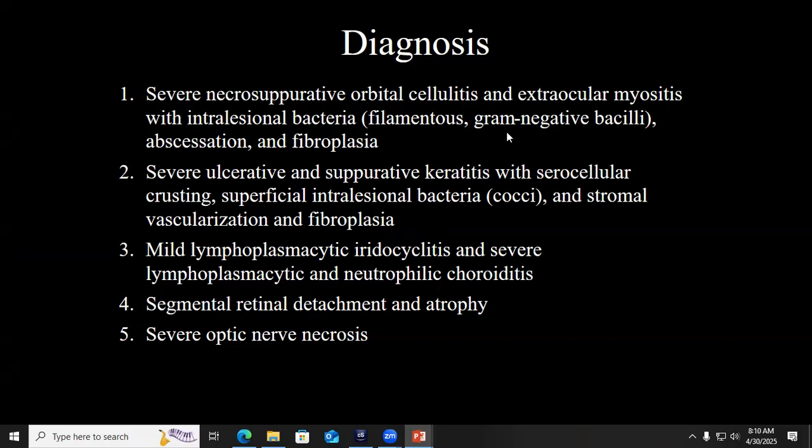So at this stage, we can't really say much else about who these bacteria are. We mentioned that culture would be needed of tissue and asked that if they did end up culturing the tissue, we would love to know the results of that. Kangaroos do like to get their own version of lumpy jaw, so they'll get facial and bony infections due to a variety of bacteria, but I think the one that's most commonly implicated is Fusobacterium, which certainly this bacteria could fit. They are filamentous gram-negative bacteria.